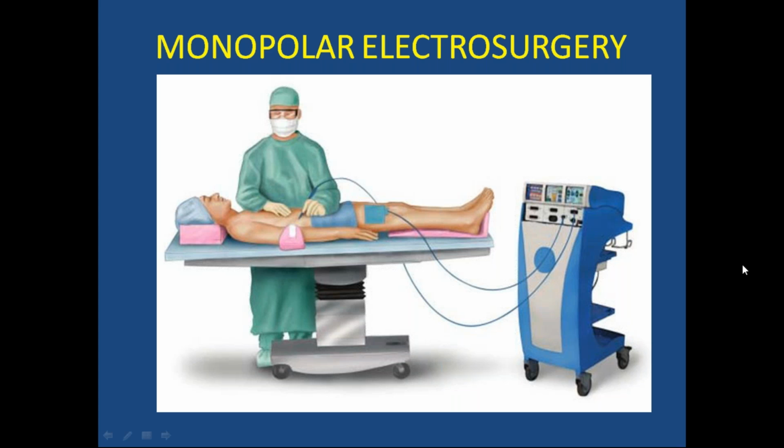So this is the electrosurgical device from where the current is generated, and it passes through the wire into the electrode pen. The surgeon is holding the electrode device, and the charring occurs, and from there the current passes back into the return electrode unit, and from there back into the electrosurgical device again. So this is the process. In the bipolar device, the current passes between these two electrodes only, but in monopolar it passes from here to the other electrosurgical active electrode.